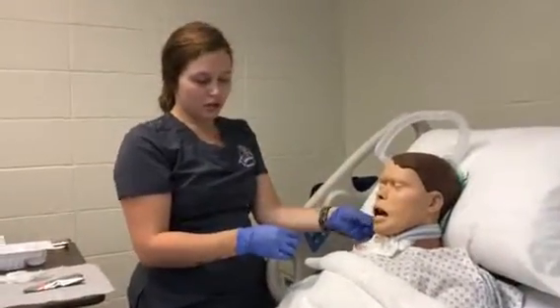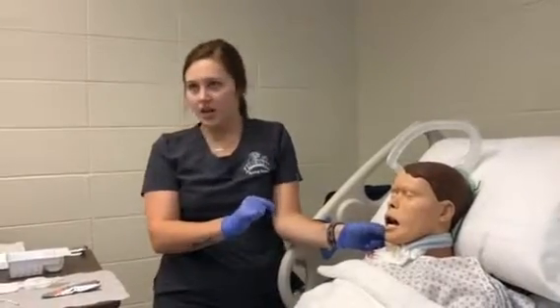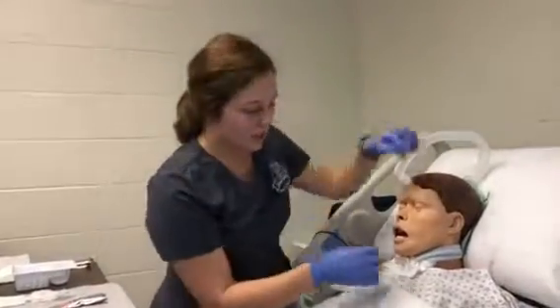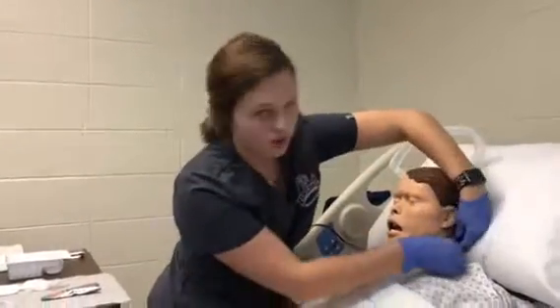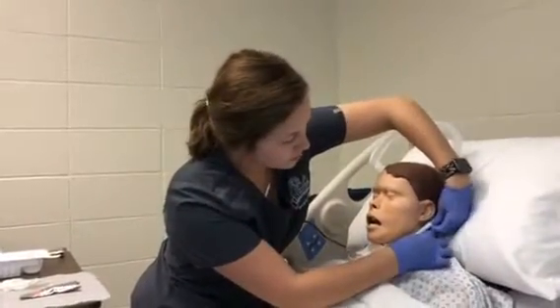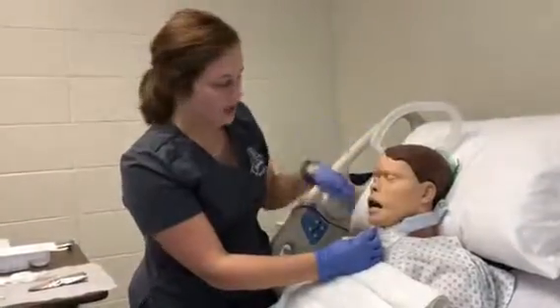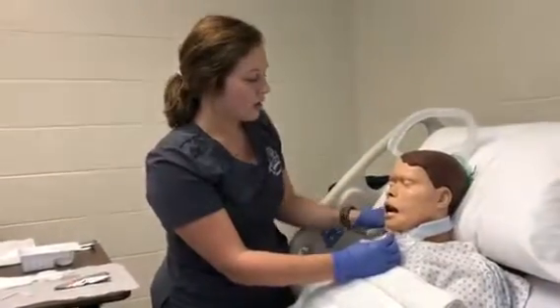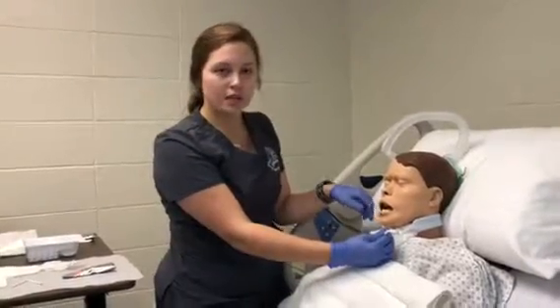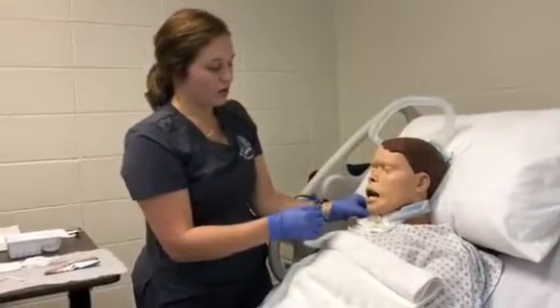Now we're going to change the trach ties. I don't have another set. But how you would change this is you do it one side at a time. So you would undo the Velcro, and you would release it from one side at a time, like I said. And most of the time these come pretty big, so you'll want to cut them to size for your patient, and then you just re-Velcro on both sides after you get it fit.